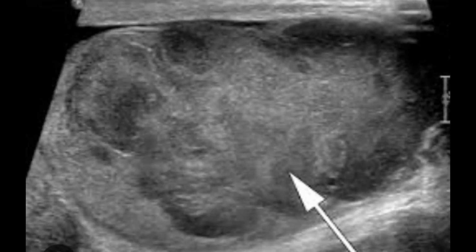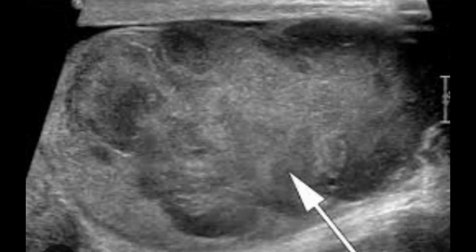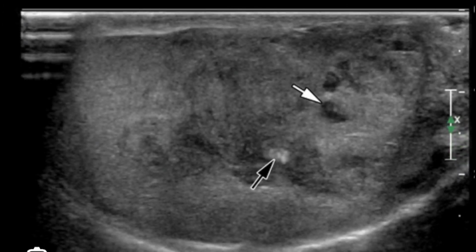And in some cases, there are a few incidents where you will see that the seminoma might replace the entire testes, which I am going to show you in the next images. Here on this image, again have a look, it is about to replace the entire testes because you cannot confirm the outline of the lesion. It is deeply penetrated, it is deeply infiltrated. However, I have shown this slide in the previous images for the cystic components and for the fluid debris and for the calcification, but the worth noting point here is that it is nearly replacing the entire testes.